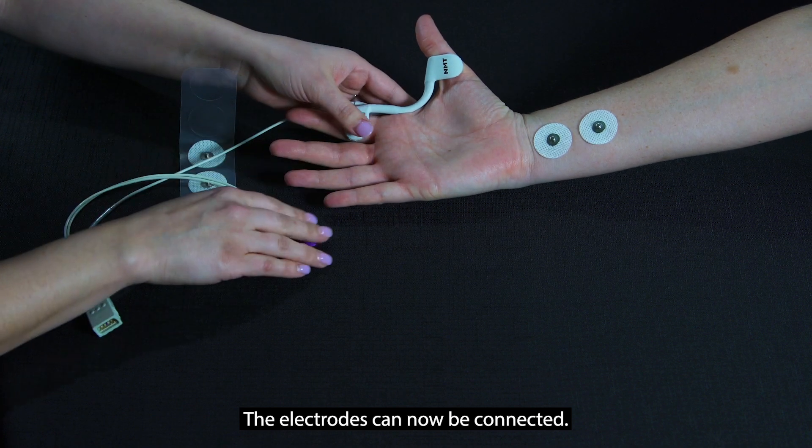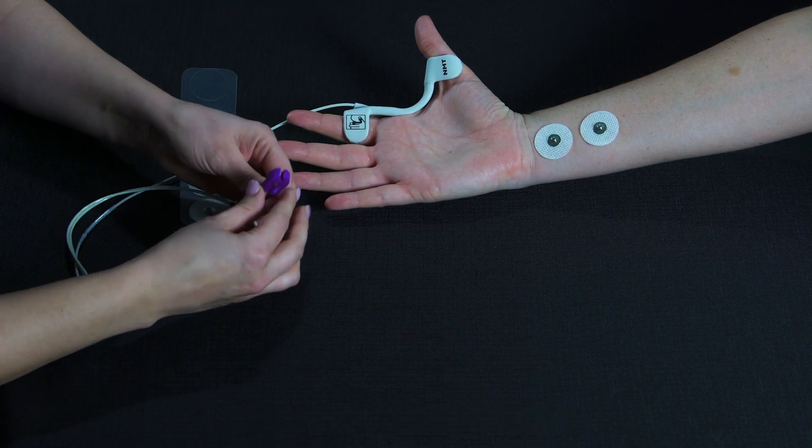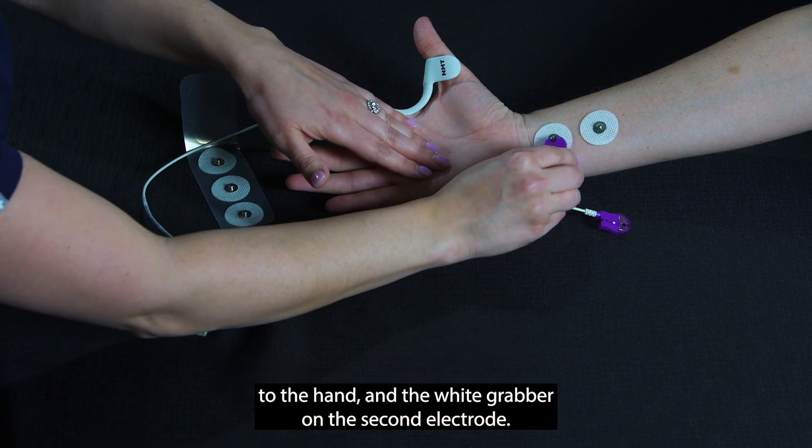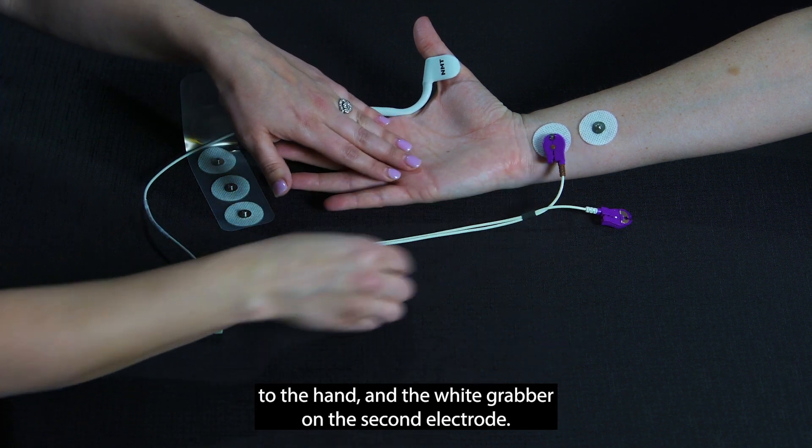The electrodes can now be connected. The brown grabber should be placed on the electrode closest to the hand, and the white grabber on the second electrode.